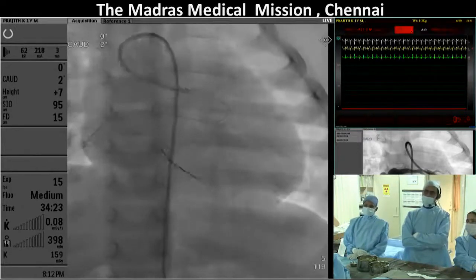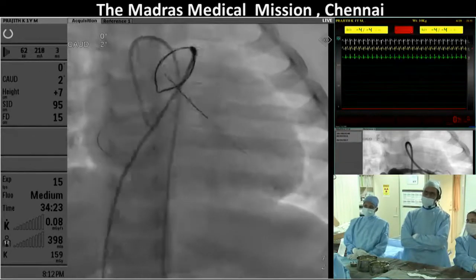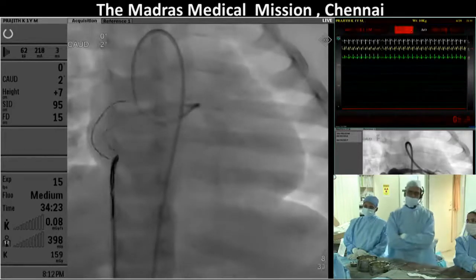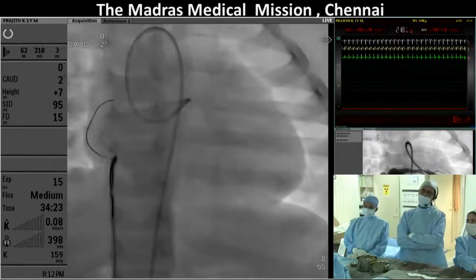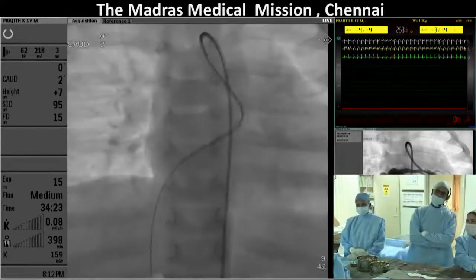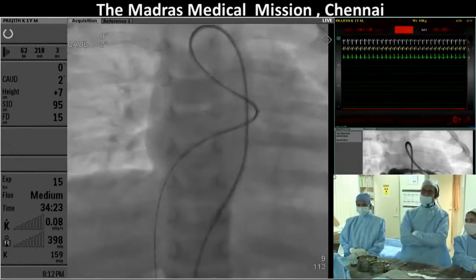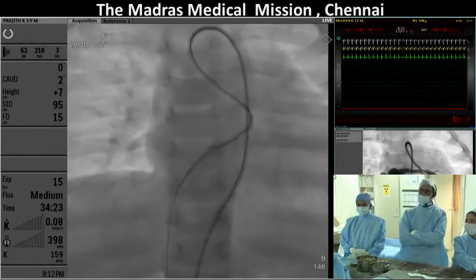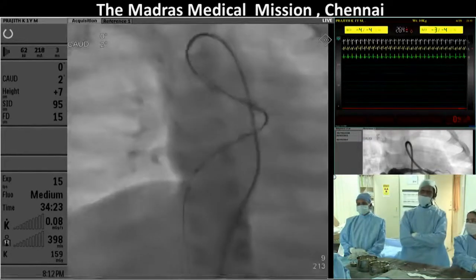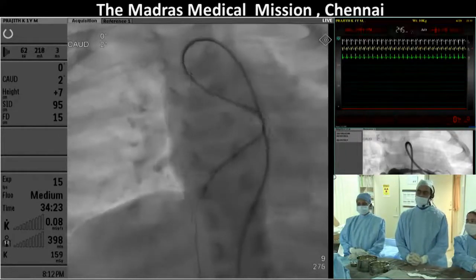And then subsequently, next. Then we got it snared. Next. The problem about, next please. We got the snare, but actually we came out through the smaller orifice. There was possibly another orifice also. So we are now through our smaller orifice, and this is not permitting the catheter to cross through.